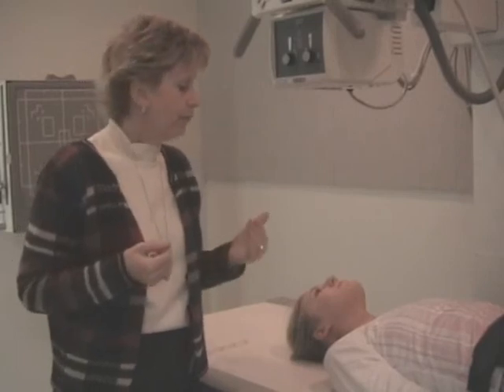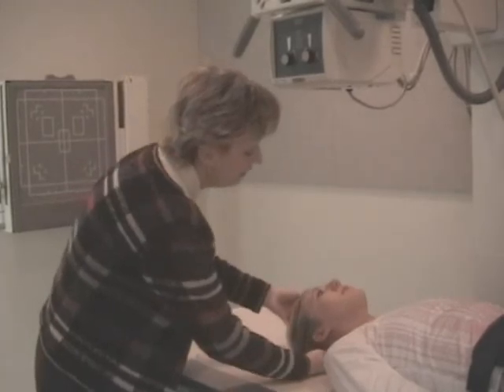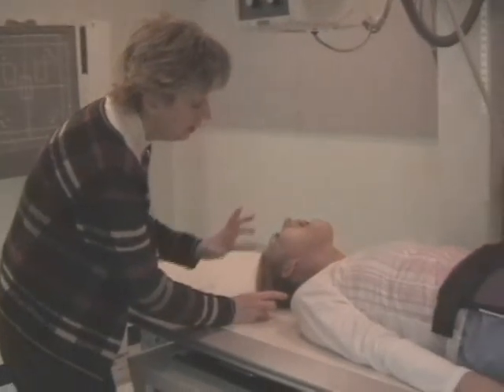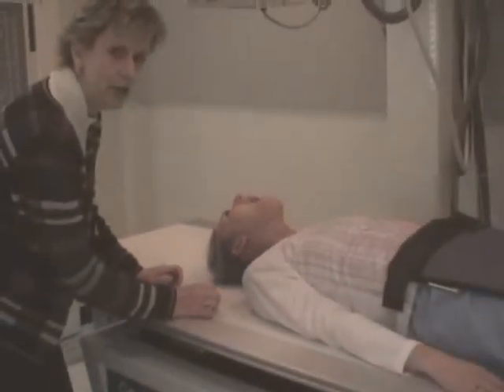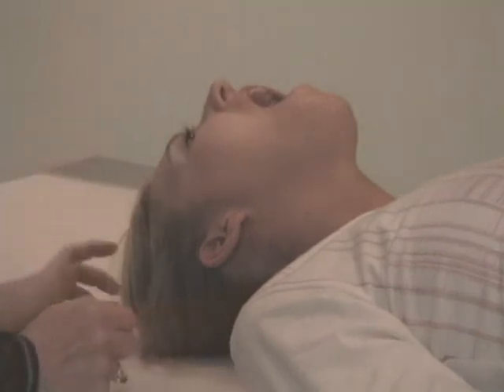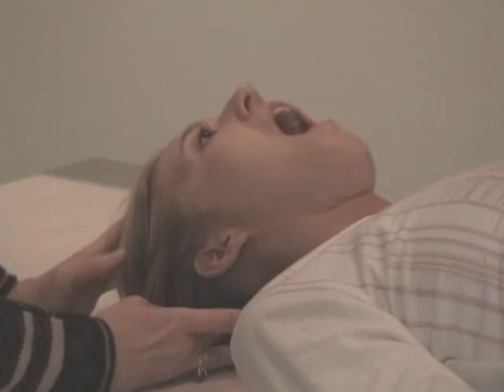If you have positioned the patient, let's mock that, Kristen, with the chin elevated like this, the base of the skull is going to be lower than the teeth. The odontoid process is not going to be cleared, class. If you don't have the odontoid process cleared, you have to look at the base of the skull, its relationship to the teeth. And if the base of the skull is low and the teeth are high, to fix the problem, you tuck the chin.